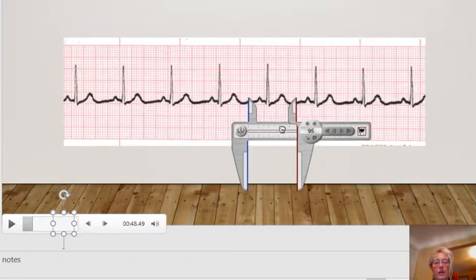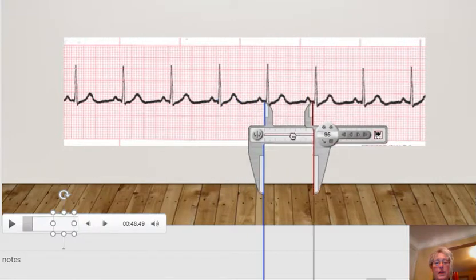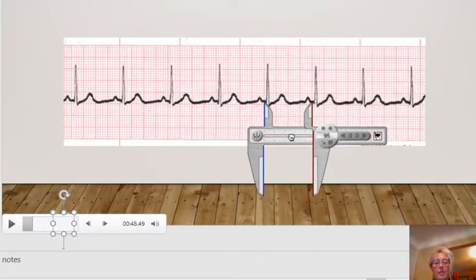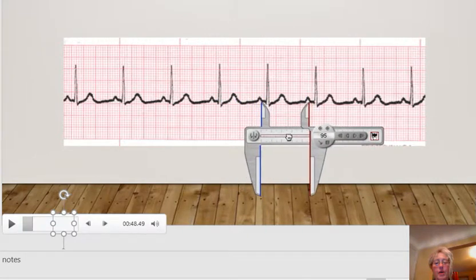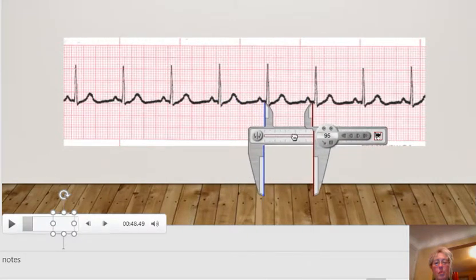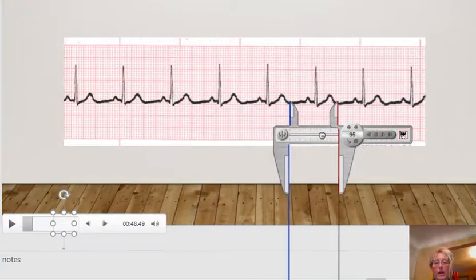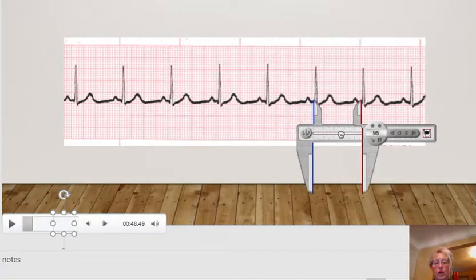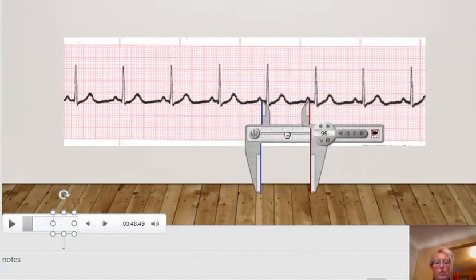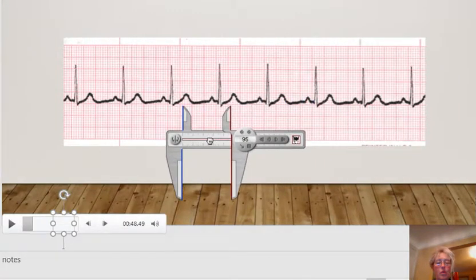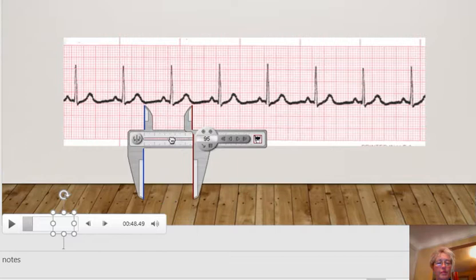So in looking at this, we're inspecting the P waves. The P waves look normal. They look even. They look regular. They're not too peaked or too rounded.